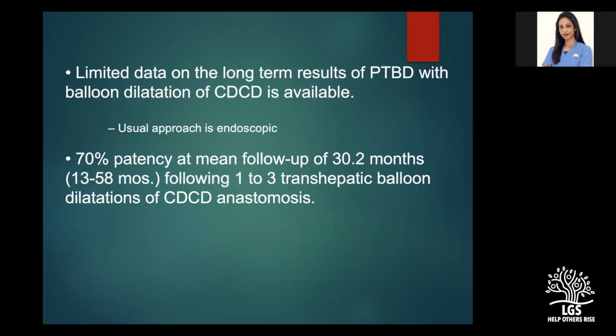And these patients, as we know, they come very often. They come every 6 weeks for repeat angioplasty. So I think we just need to be patient. We have to treat them repeatedly, because if it's a fibrotic stricture, again, it collapses because we're not inserting a metal stent here. All that we are doing is putting a plastic internal external drain. And that is the reason when they come back to us again, it would have collapsed, and again, you would see a stricture. So a constant repetitive balloon dilatation will definitely go a long way.